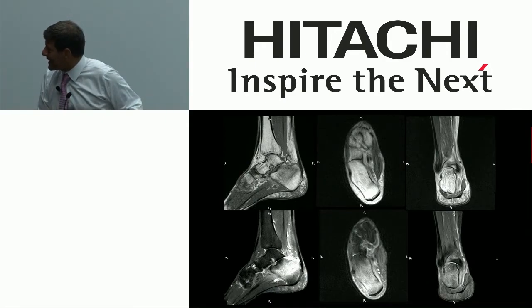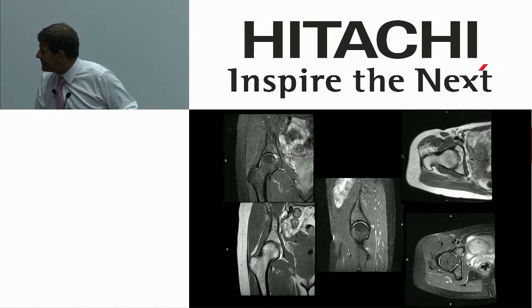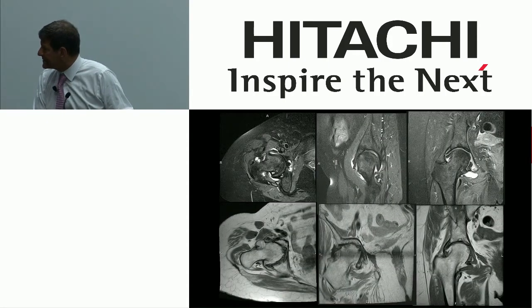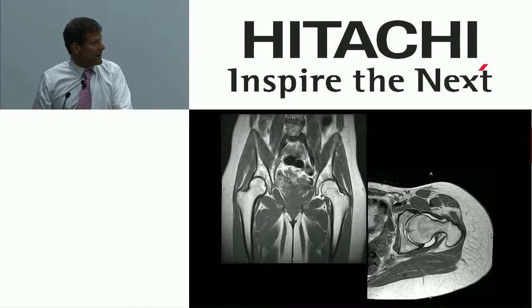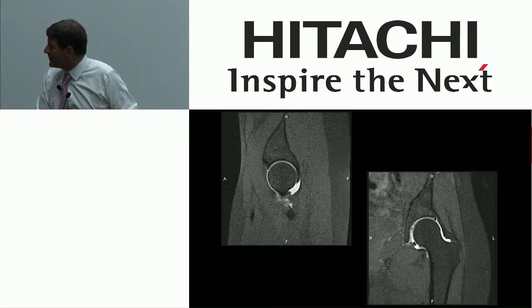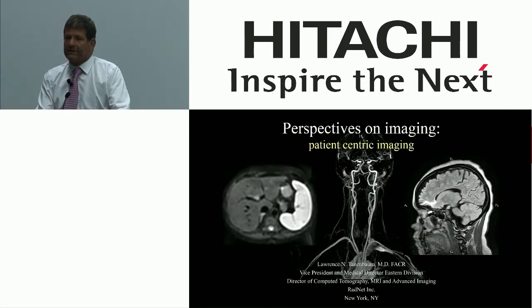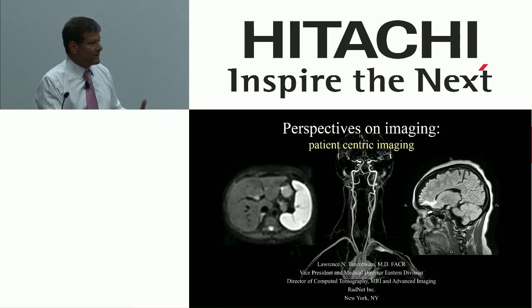Here you see a calcaneal fracture. Here you see a hip exam, the kind of thing that's challenging even on high field systems. It can be done really quite nicely on these open design high field systems. Again, just a typical arthrogram, T1 fat sat, long bone study. A lot of things to look at. Running through images is really just designed to build a comfort level. But you see what we're after, okay?